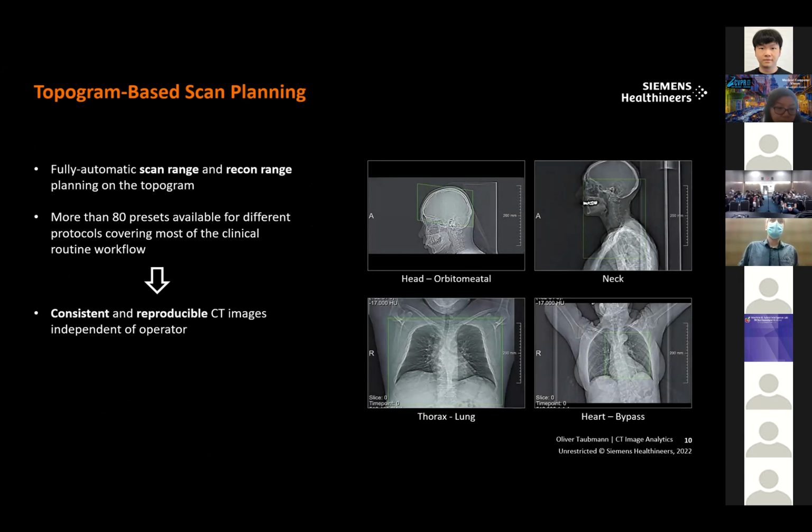and again prone to unwanted variation, especially because there's actually a plethora of ranges which vary mildly between all the different clinical indications that you can have. And some are even a little more involved. For instance, if you scan the brain, typically you want to avoid unnecessary exposure of the eyes to radiation, so you would even tilt the gantry. And again, here models can help make that more consistent and reproducible.